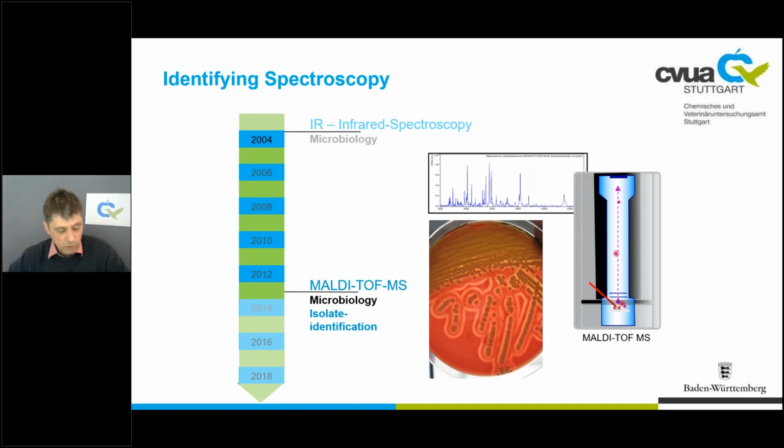Identifying spectroscopy has been used for microbes since 2004. It was first introduced by infrared spectroscopy, and MALDI was added in 2013, also first for the usual application, microbiology.